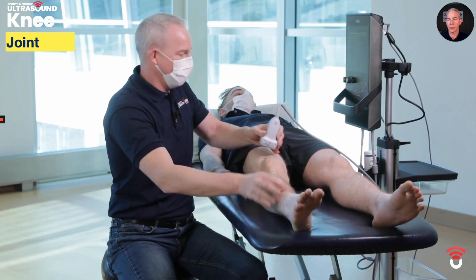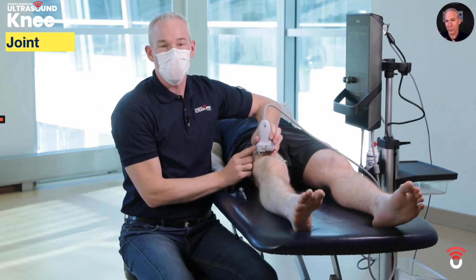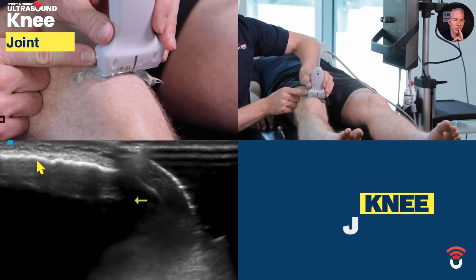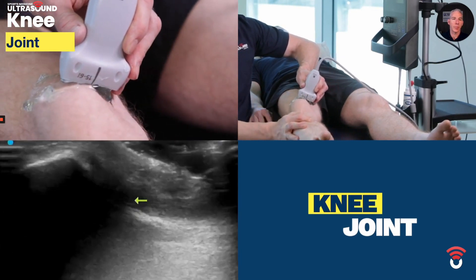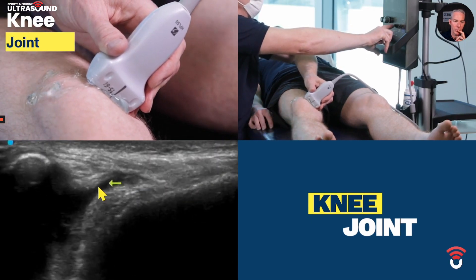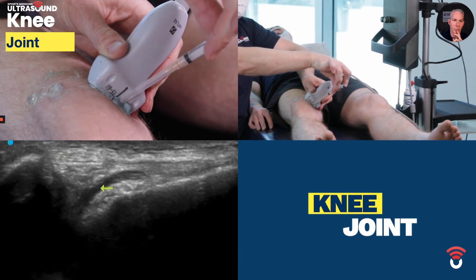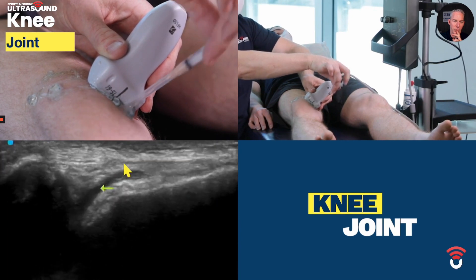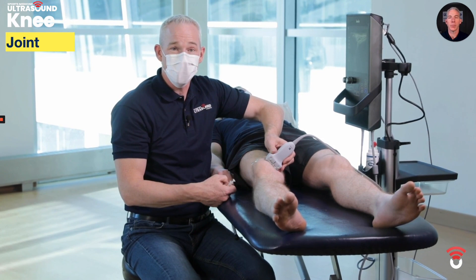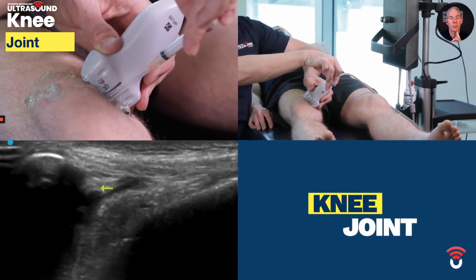We take the leg straight, add a bit more gel, and keep our probe with the same orientation. The landmark is once again the patella, but now we're going to drop the probe onto the medial femur. We can see the hypoechoic knee joint fluid here, and to inject it all we have to do is drop our needle out of plane into the knee joint fluid. So that's how I normally scan and inject the knee joint in the suprapatellar recess, but if you can't see enough fluid to inject, you can always default to this medial patellofemoral approach out of plane straight down.